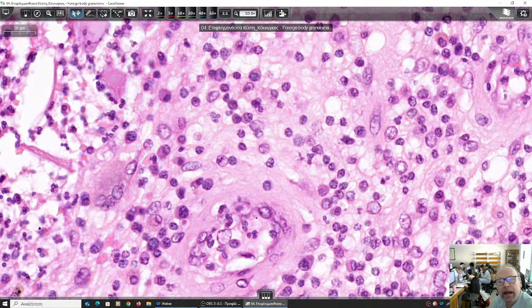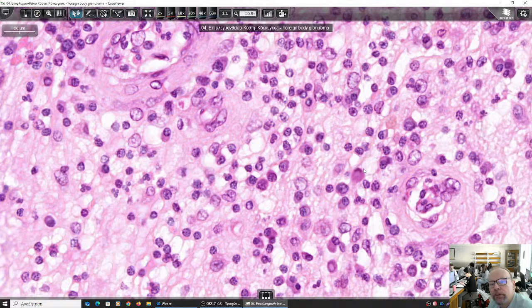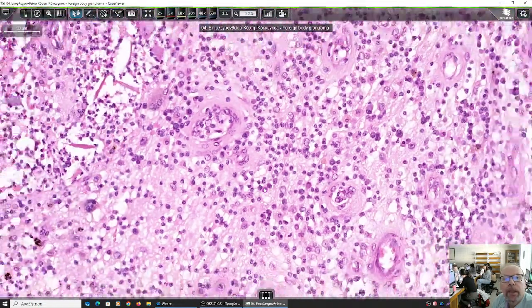So have a look at these plasmacytes, this one. But you just know information and you came to a conclusion. You don't see it, right? You cannot see and distinguish. Sometimes you can see the immunoglobulin deposited in the tissue, but it's not always the case. You cannot tell it's a T cell or a B cell. You just know the context. If you see the plasmacyte, you know that it is a B cell, because B cells secrete immunoglobulin. If you see a small lymphocyte like this one with minimal cytoplasm, you cannot tell. Is it a B cell, a mature lymphocyte, a B, or a T? You cannot tell.